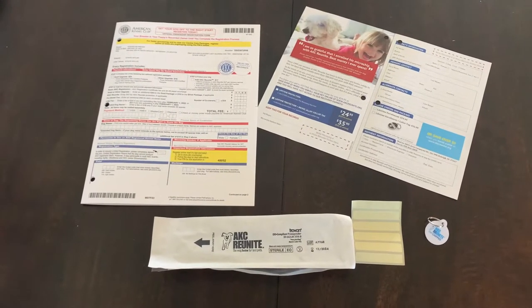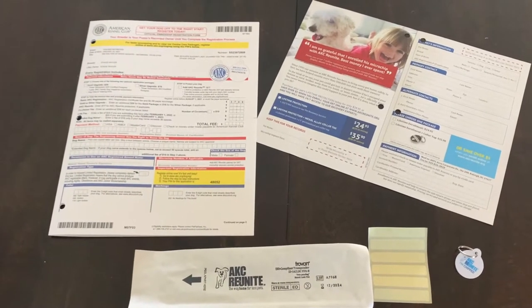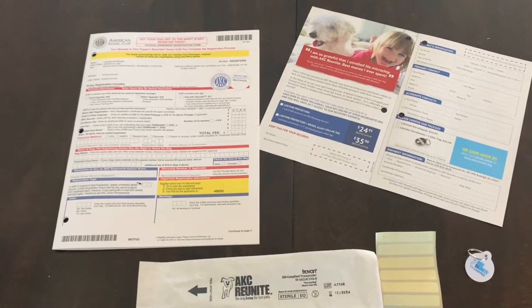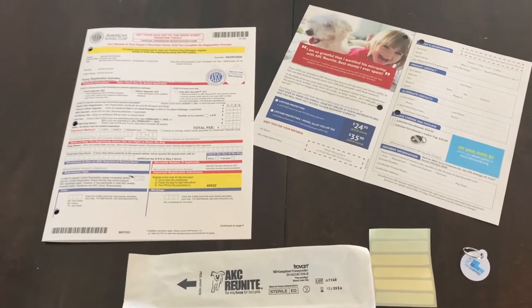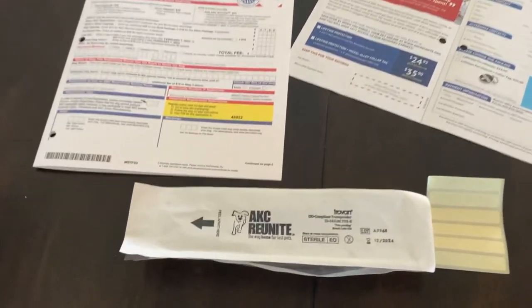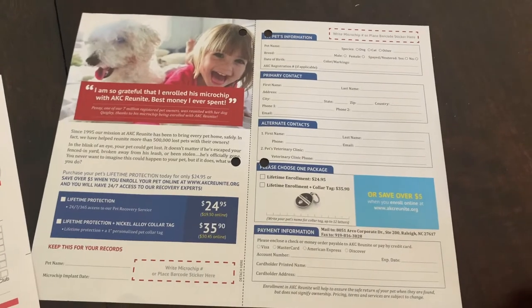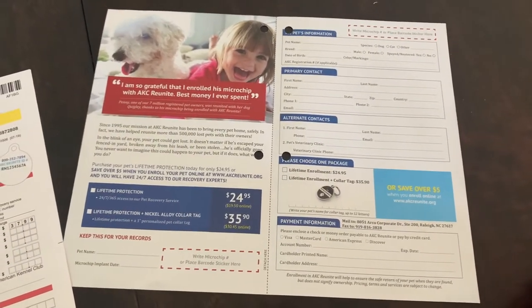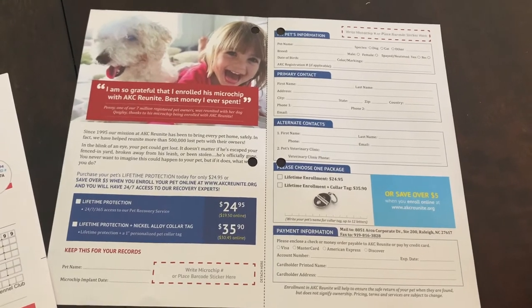Today I'm getting ready to microchip one of our golden retriever puppies. I'll start by showing you what microchips we are using. We're going to use the AKC Reunite microchip. It comes with a brochure that you can fill out and send back to AKC to register your animal's microchip number for its life. It costs $24.95 and that is a lifetime registration.